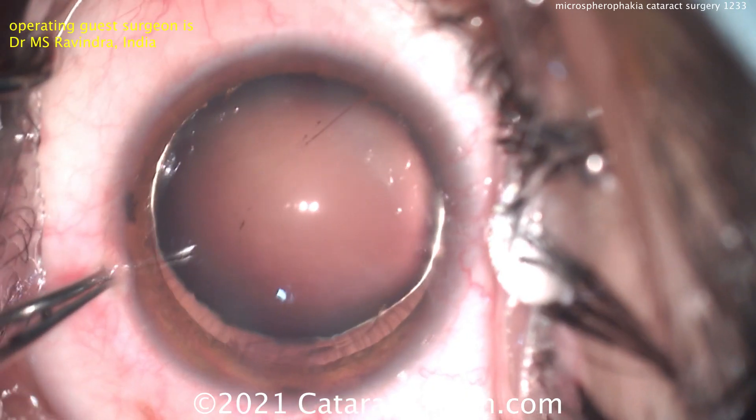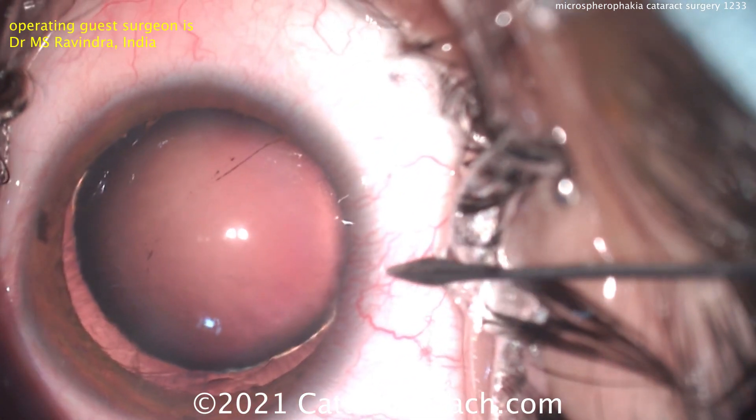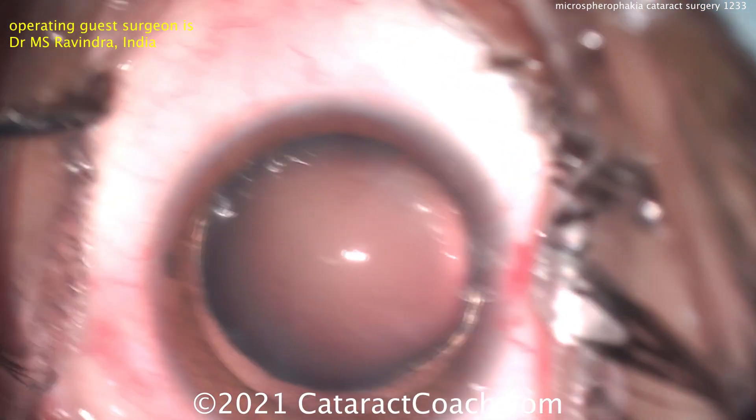The key here is how do we create that rhexis? To create a capsulorrhexis is tough because this lens has very weak zonular support. So when you go to grab that anterior lens capsule, it's going to tend to wrinkle on you.